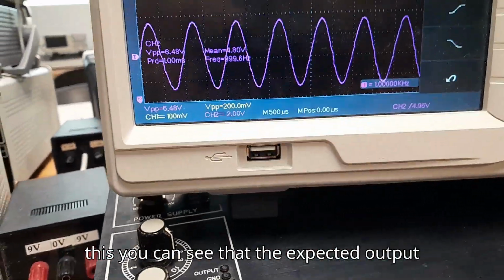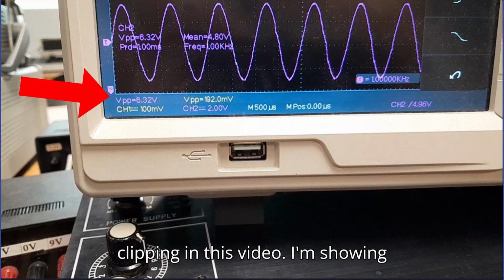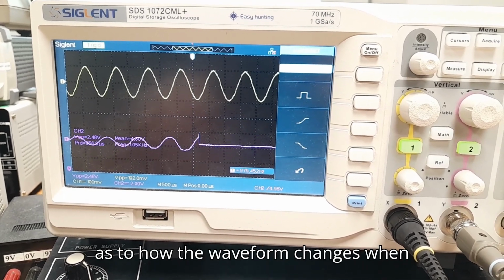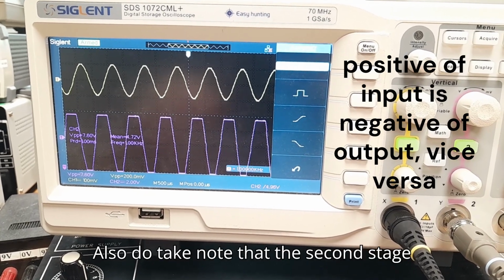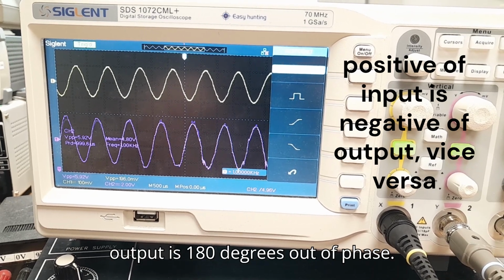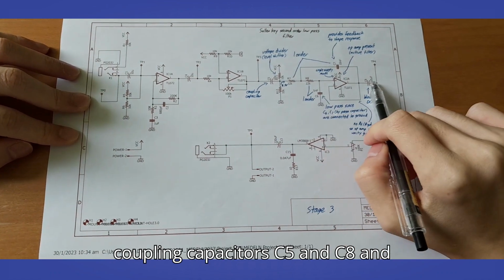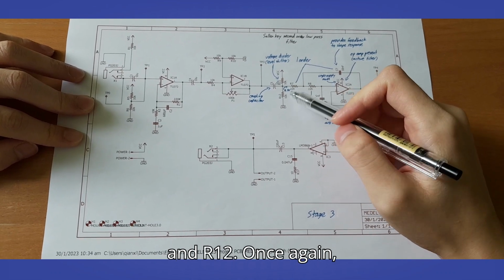From this, you can see that the expected output waveform should be around 6 volts without clipping. In this video, I'm showing just the oscilloscope for a clearer view as to how the waveform changes when adjusted by the trimmer. Also, do take note that the second stage is an inverting amplifier, hence the output is 180 degrees out of phase. For stage 3, we see yet again more coupling capacitors C5 and C8, and another voltage divider consisting of R11 and R12.